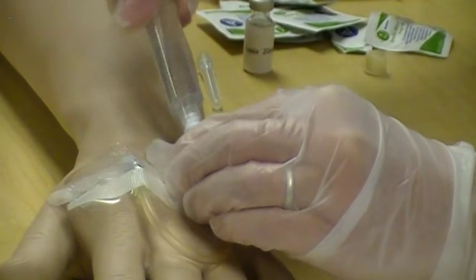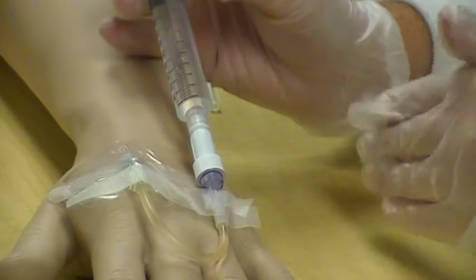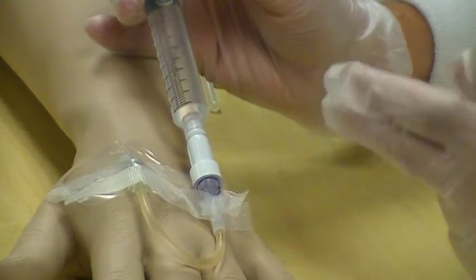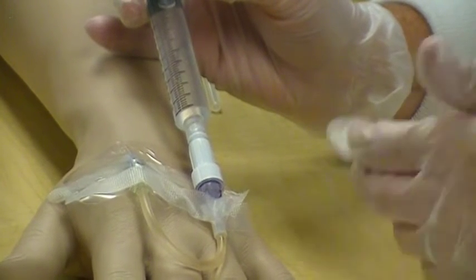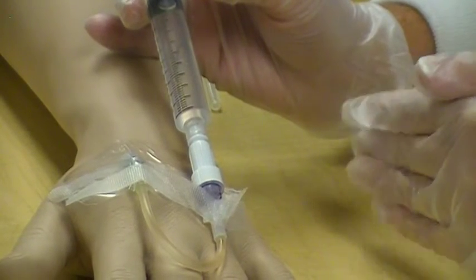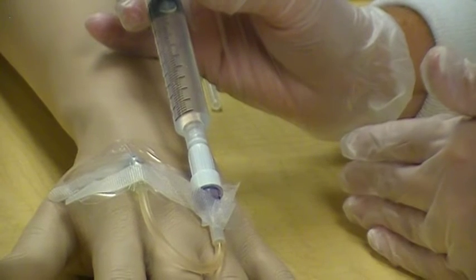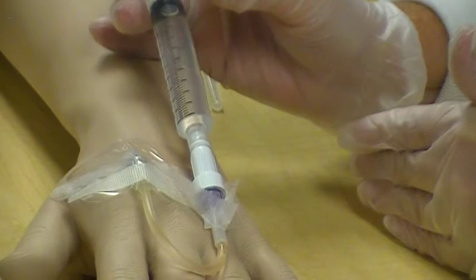We're going to apply our saline flush, and this time we talked about in the first flush that we're going to push that 1 milliliter over 1 minute. For the second push, because what we're actually pushing is the medication into the patient, we want to push it at the same rate that we push the medication. Therefore, we pushed one medication over 30 seconds to a minute, so we want to go about another minute with this. The amount that you push, again, is going to be determined by the facility. Again, it can be anywhere from about 1 to 5 milliliters. Again, for demonstration purposes, we're just going to do the 1 milliliter, which is what you'll do for checkoff.